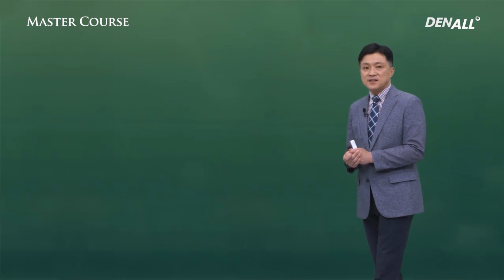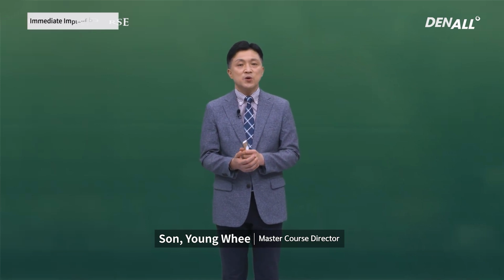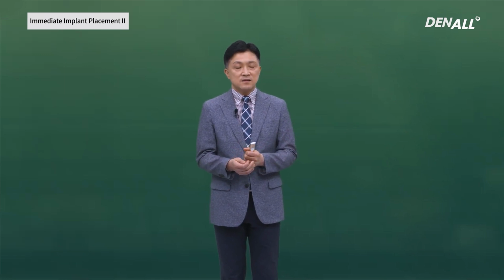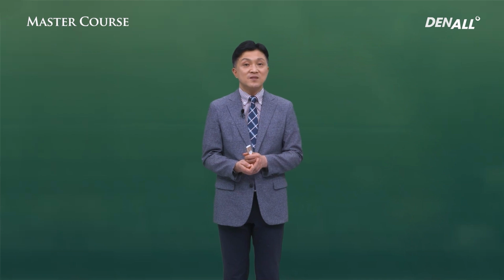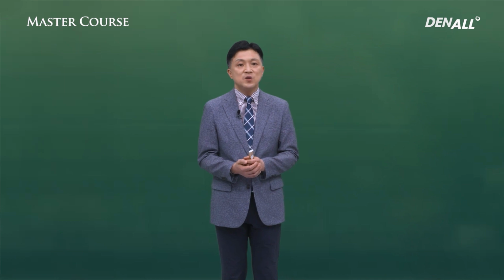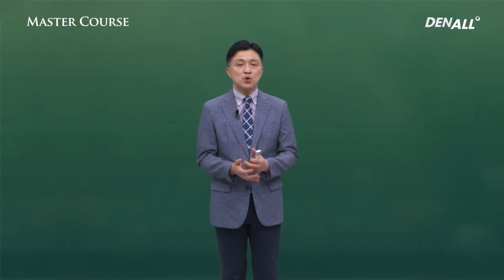Did you enjoy the second lecture on immediate implant placement? Immediate implant placement can reduce the treatment time for the patient as well as the number of surgeries. Therefore, it is easier to get the patient's acceptance. In the case of upper anterior, this can be utilized along with other methods to preserve papilla. There are many benefits with this treatment modality. However, as with all different types of treatment, there exist complications and there are factors that we need to consider.